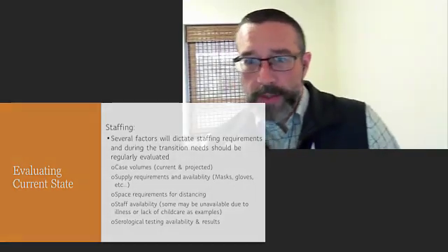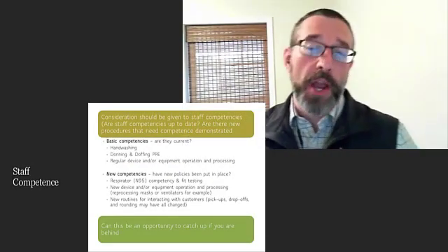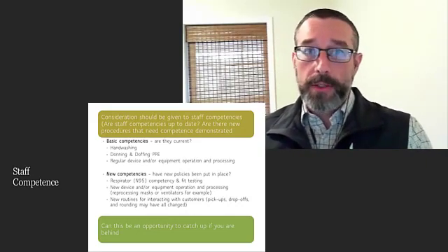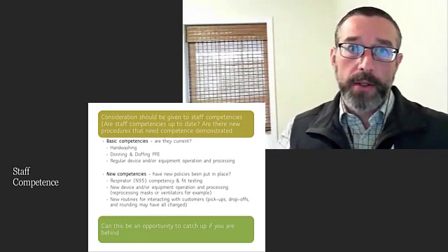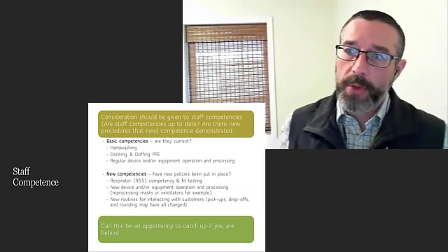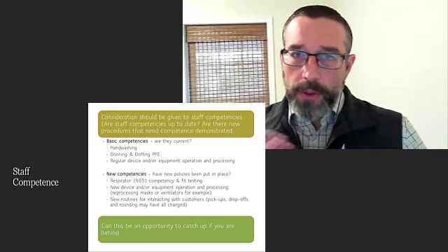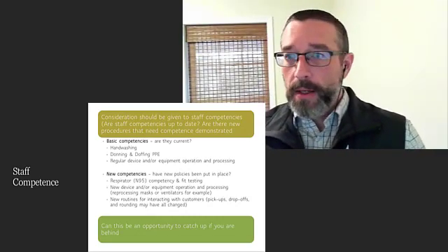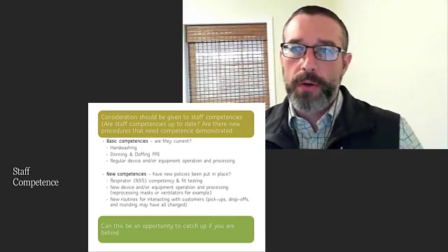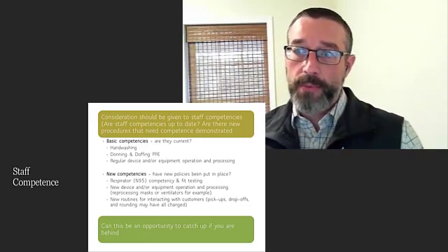A few more things to think about is, as an educator, staff competence is close to my heart. It always has been. It was a large undertaking at the facility that I worked at. It took about a third of my year getting every staff member in the CS department competent. So there's just a few things to consider when you're doing this, and are they up to date? So that's always going to be a big thing. It was always a struggle. There's a few basic ones that you really have to think about in this way.